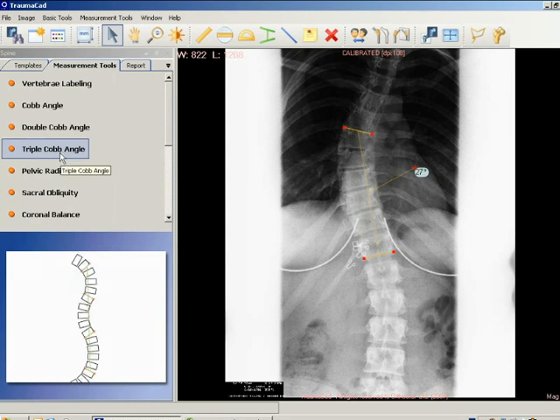As a general rule, a Cobb angle of 10 degrees is regarded as a minimum angulation to define scoliosis.